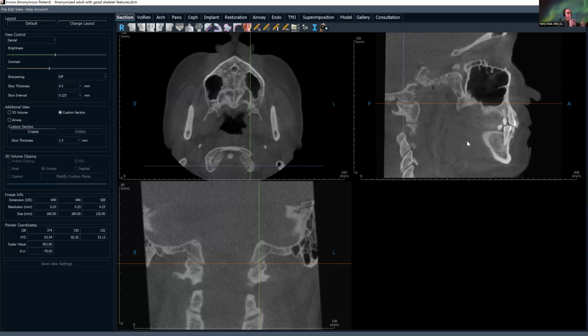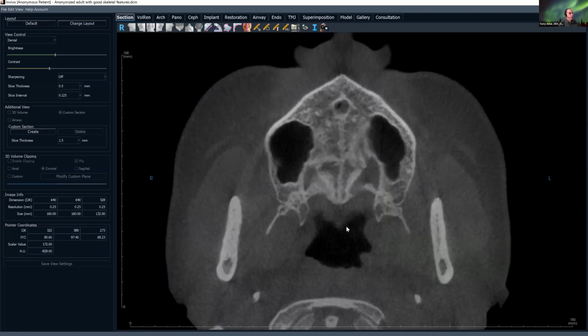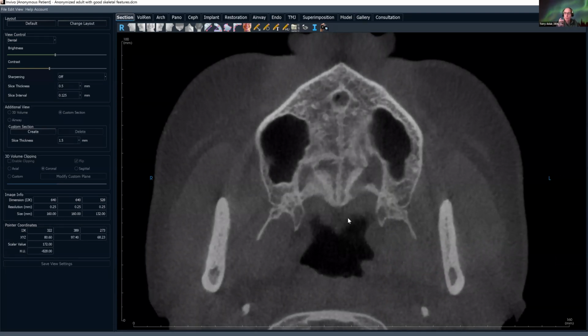We're not finished yet. And as you can see, I've kept it in these orthogonal views so I can quickly scroll through these. But now I come to the nearest and dearest part of what we do, which is to look at teeth. I save that for last. Because this is important, I generally want to enlarge this, so I'll magnify this. And at this point, I am going to rely on hand scrolling superiorly, inferiorly, because I'm beginning to look at the dental structures. And we never want to miss things for sure.